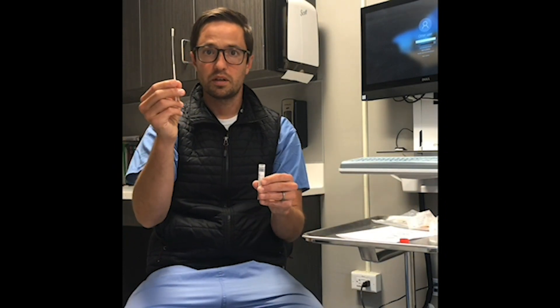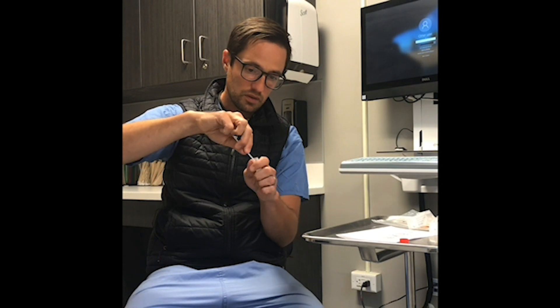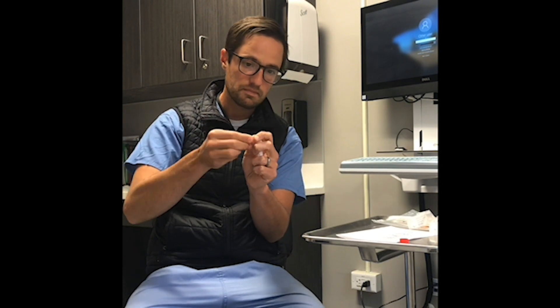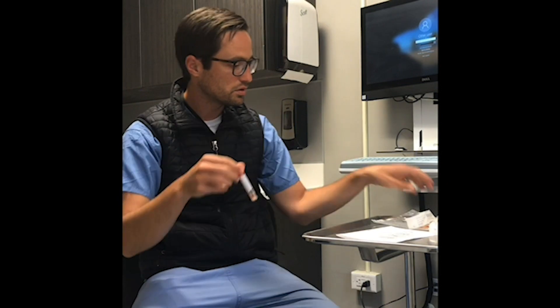Not touching the cotton end of the swab, gently return the swab to the collection vial. Break off the top at the score line and then cap the sample. Firmly close the tube.